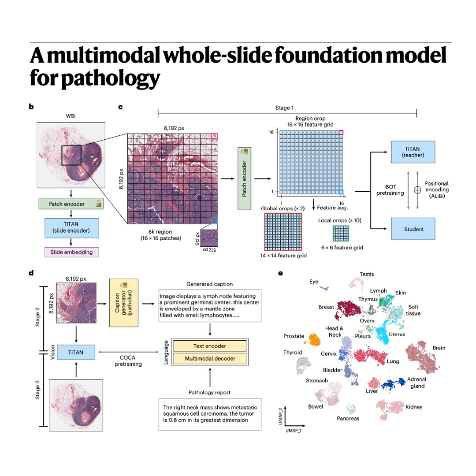That is the architectural innovation that really sets Titan apart. Standard models just fall apart because an entire WSI can generate over 10,000 tokens in that feature grid. And with attention mechanisms, the computational cost explodes quadratically. Yeah. It's infeasible. So what's the solution? Titan's solution is a really clever strategy called train short, test long. They train the model on those smaller, manageable 8K by 8K regions. Okay. But they need a mathematical way to make sure that knowledge reliably extends to the full, potentially gargantuan WSI during actual use. And they do this using something called 2D attention with linear bias, or ALiBi.